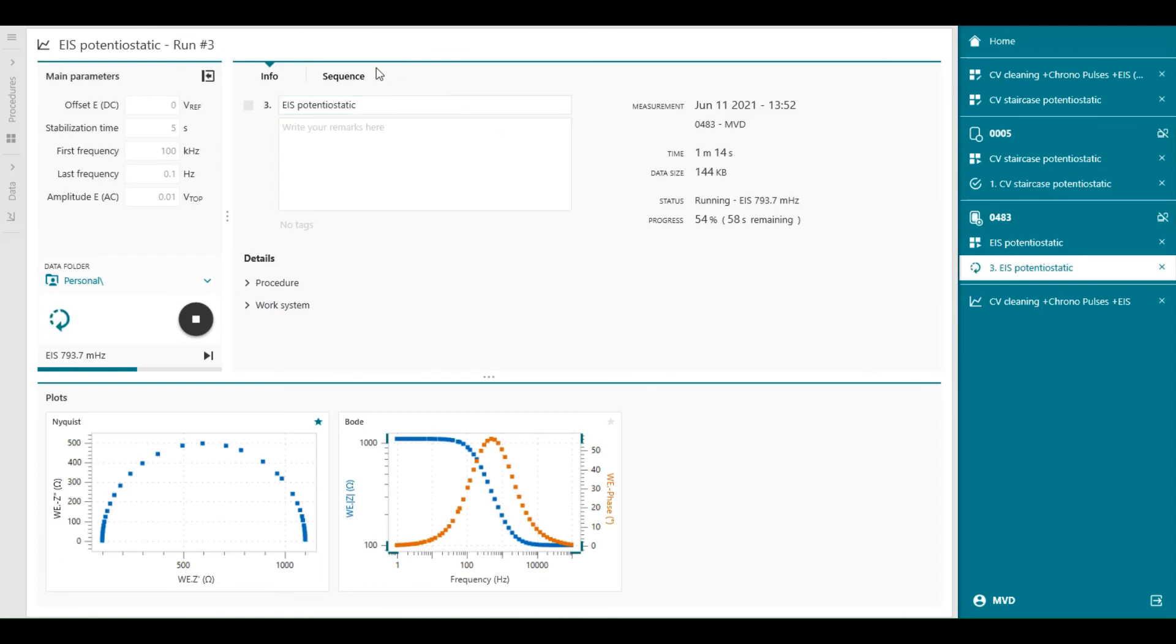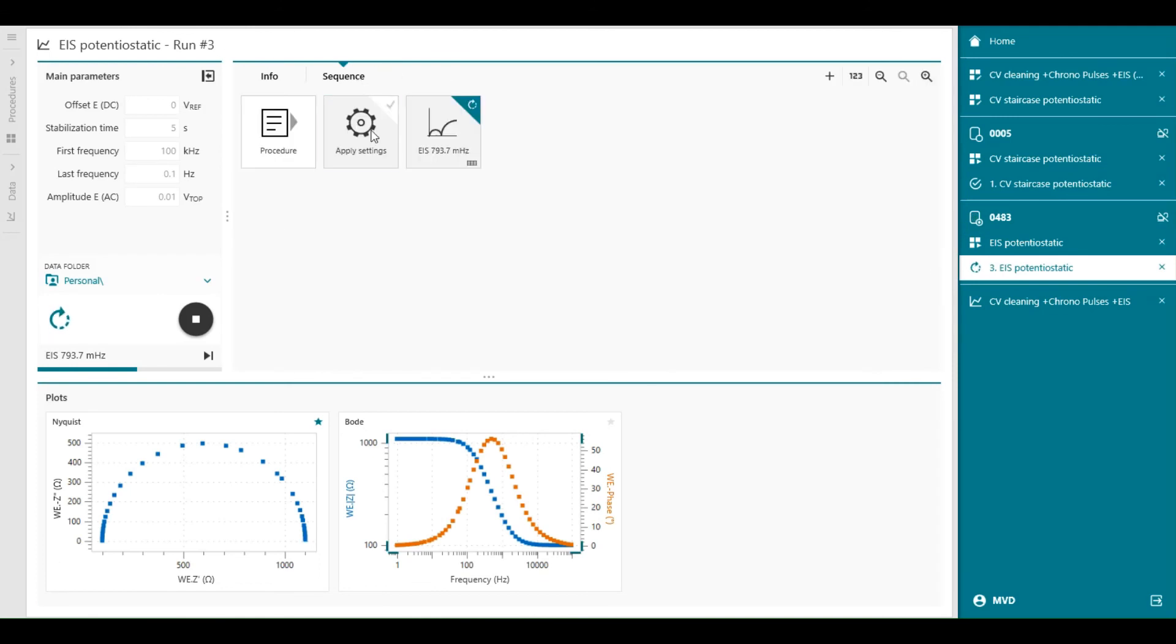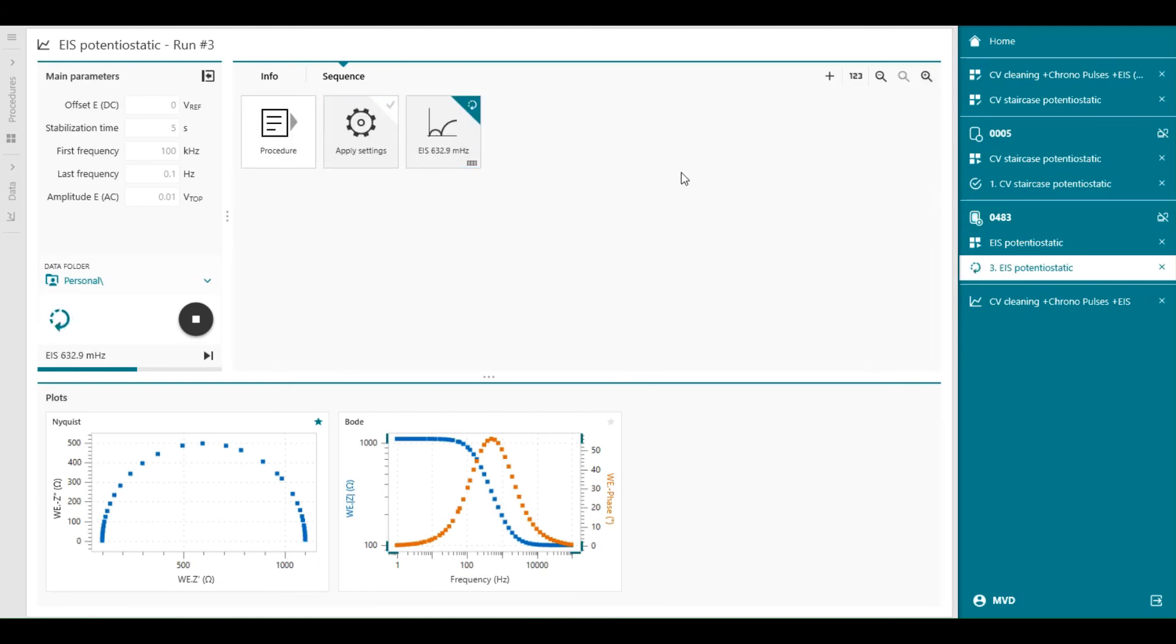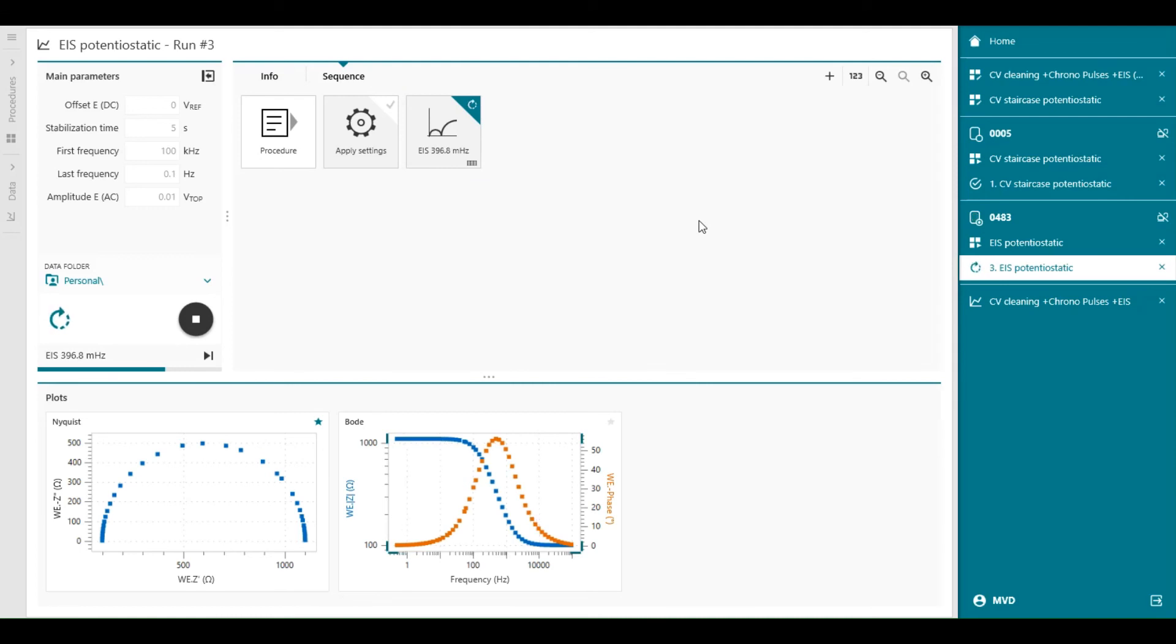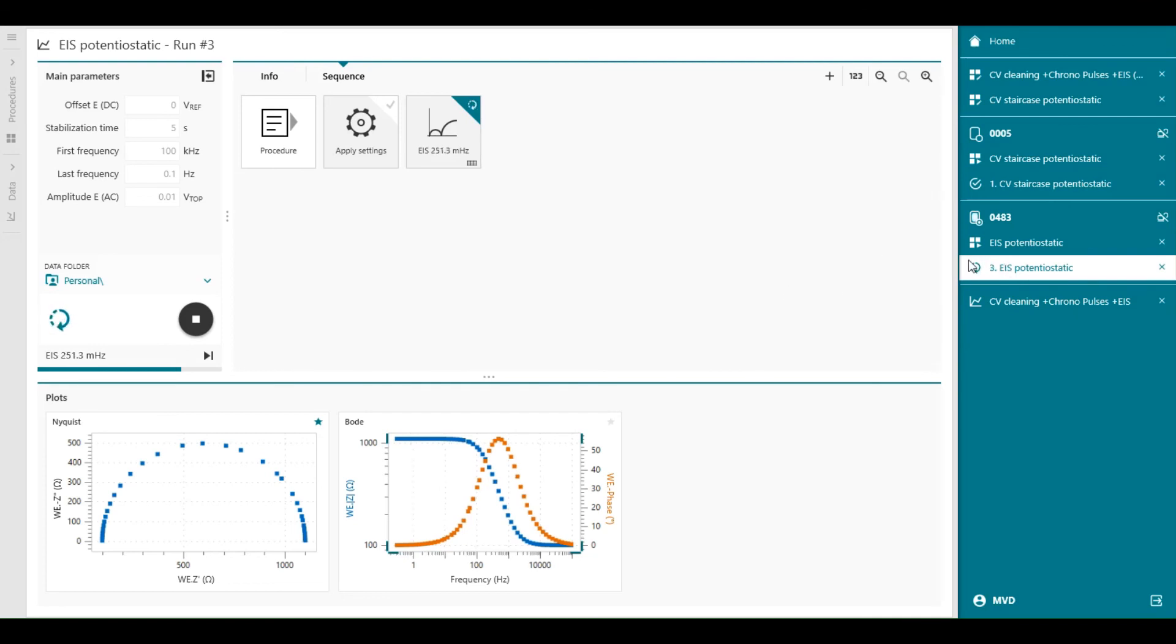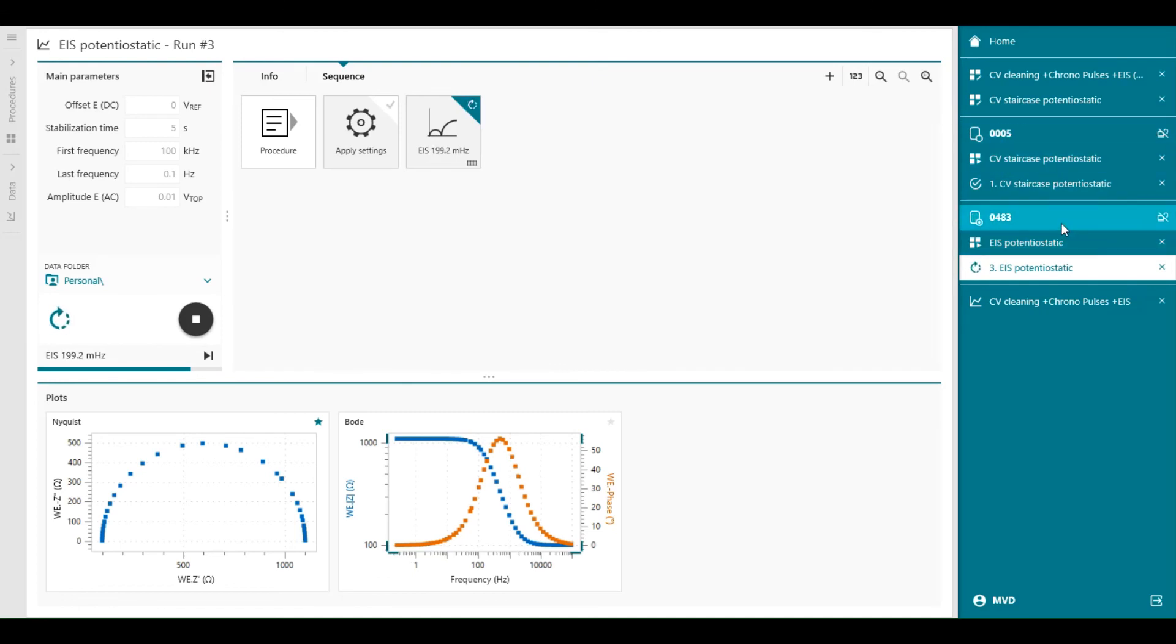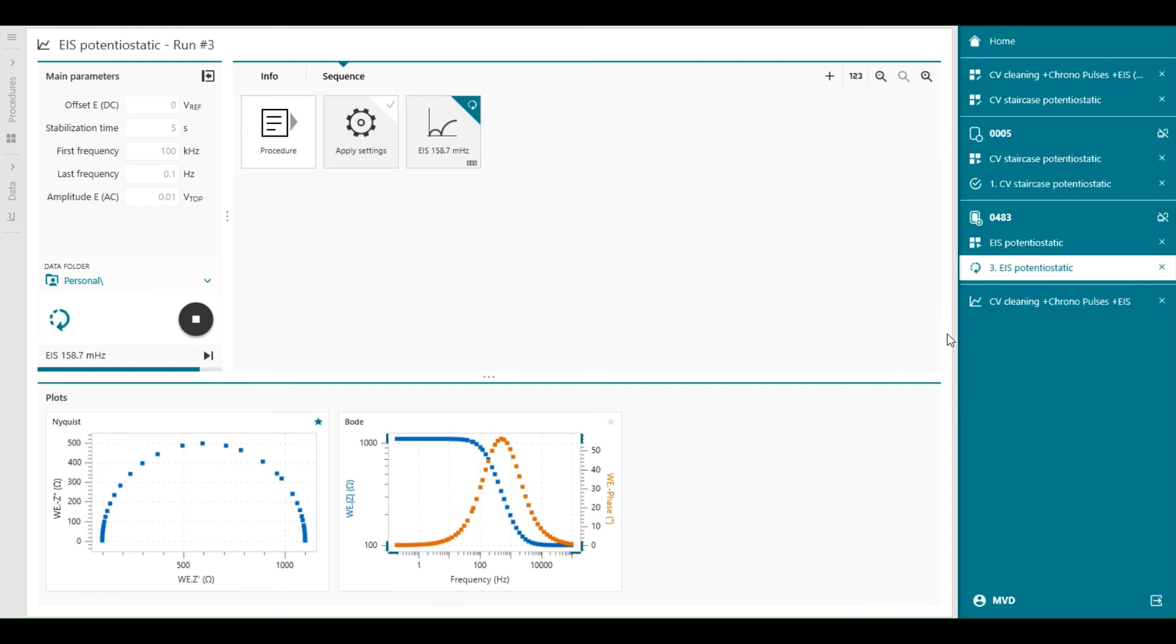And we can also follow on the manual control where it is, and in the sequence at which frequency we are. So we can also follow, we're now at 630, 500 millihertz for example, and it goes down to 100 millihertz. So the measurement is still running. But you can see that it's organized by work system and by sessions.